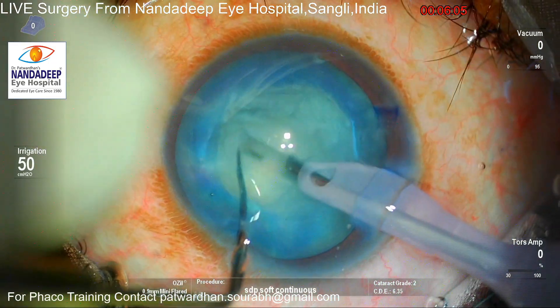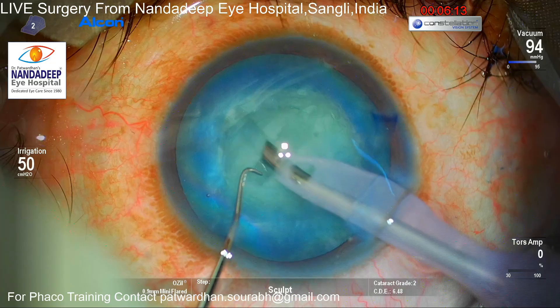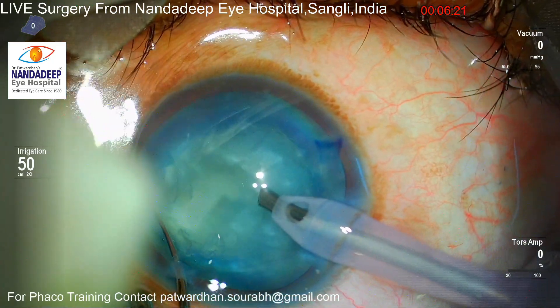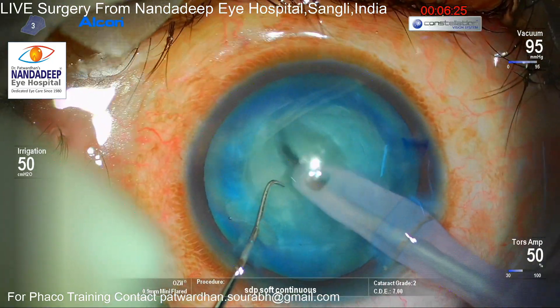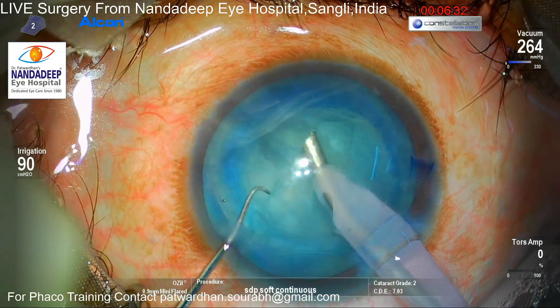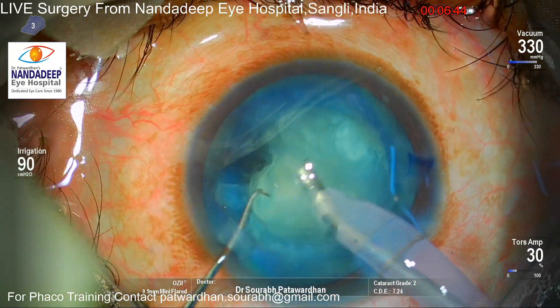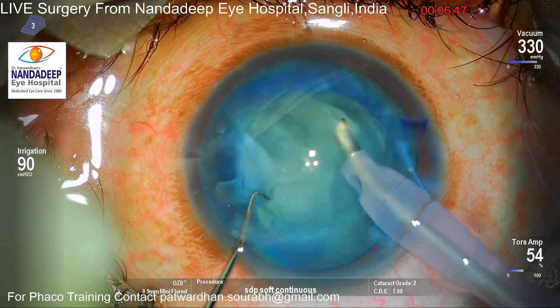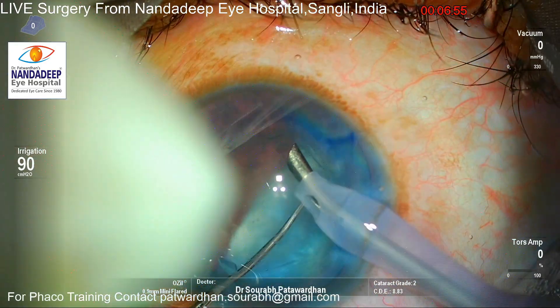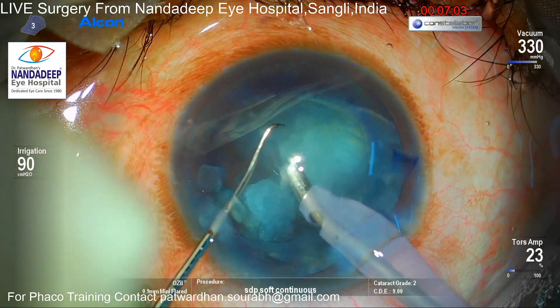It's difficult to place the CCC mark around the visual axis. Nucleus rotation was done and then we started with phaco. Remember this is a post-traumatic cataract, so we have to keep watching for any capsular issues or weak zones. I'm being very careful here — doing simple chop and divide, using just 50 centimeters of bottle height, and once the nucleus is divided I'm going to aspirate it out using phaco sideways and Ozil.